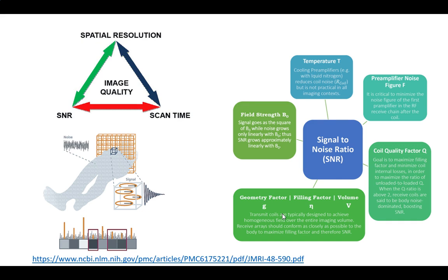That's about the only unilateral improvement you can make. I crank that field strength up. It's going to make it really hot, but I've submerged it in liquid helium, so life's good anyway. So that's a cost thing, but it is a direct benefit, and I don't cause problems to the others. That's just a money interference one.